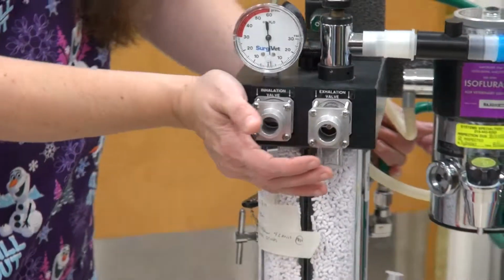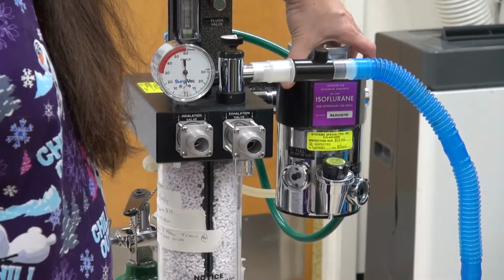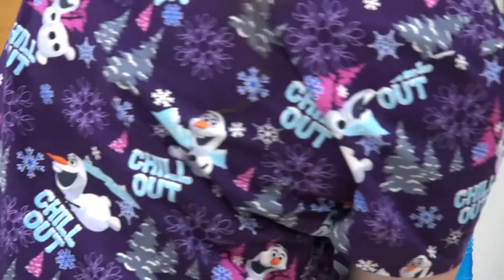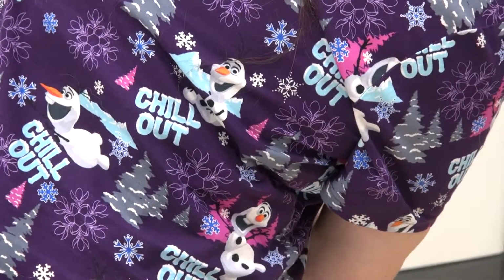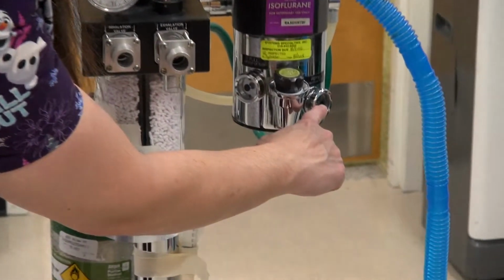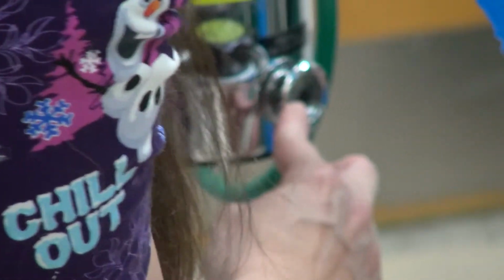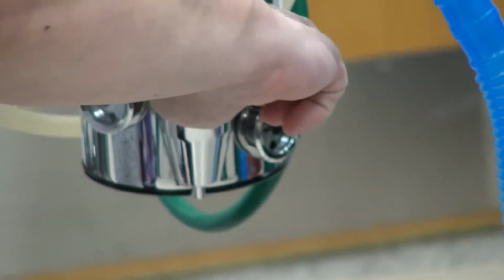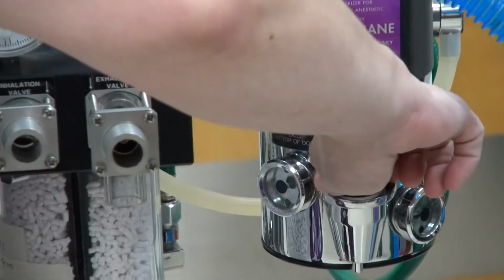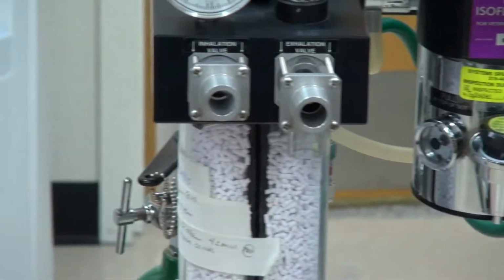So then we want to check our vaporizer level. Where are we looking? We're looking right here, correct? See this big dot here? Same thing. That's your fill level right there. That's going to tell us how much is in our vaporizer, and it's going to say refill at the bottom of the dot. This machine's great, self-explanatory. Right here is our reservoir to put our liquid in this machine, okay? So we're going to check that.